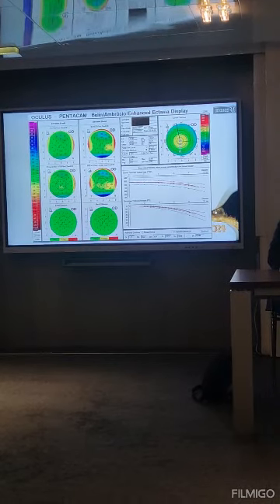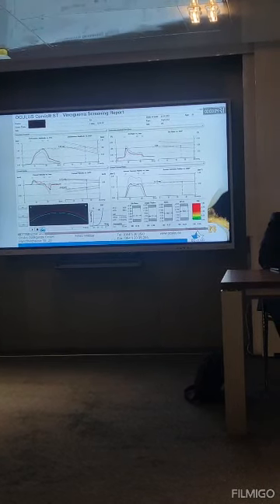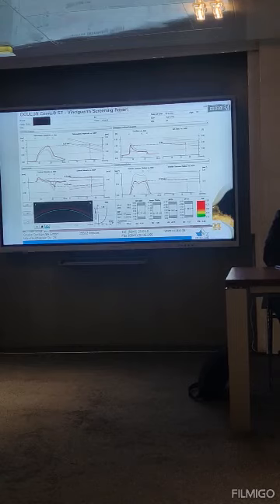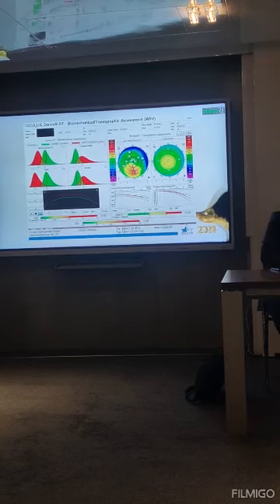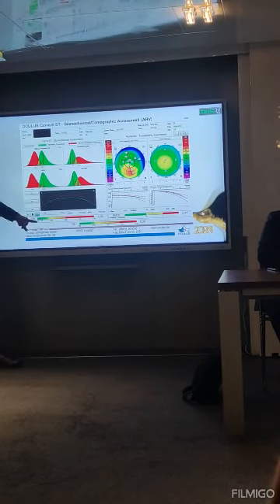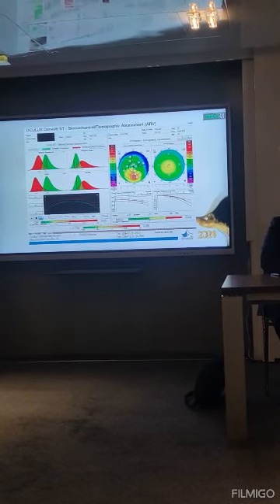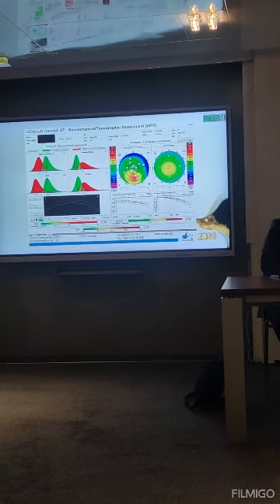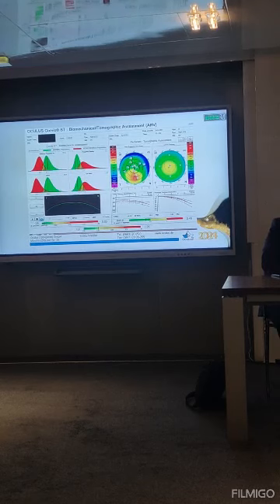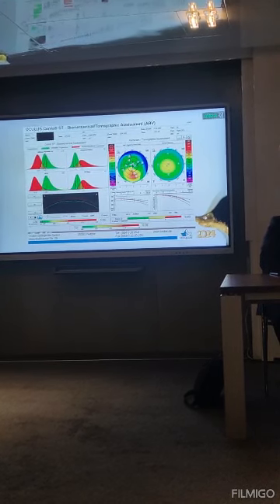As you can see, this is the importance of multimodal imaging, or having an extra piece of information, which is the biomechanics here. We did a Corvis for this patient, and as you can see the CBI is perfect. We know that the BAD is good, and we now have the CBI good, and now the TBI also gives us a very good result, which means this inferior steepening is not a focal biomechanical error, because we know keratoconus starts anterior or posterior or whatever, but at the end of the day, it's a focal biomechanical failure or weakness.